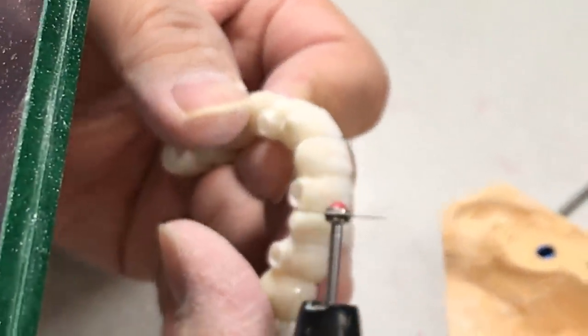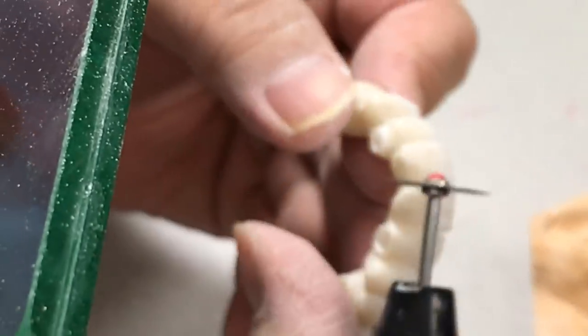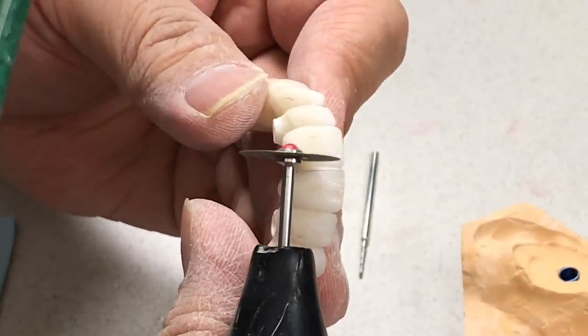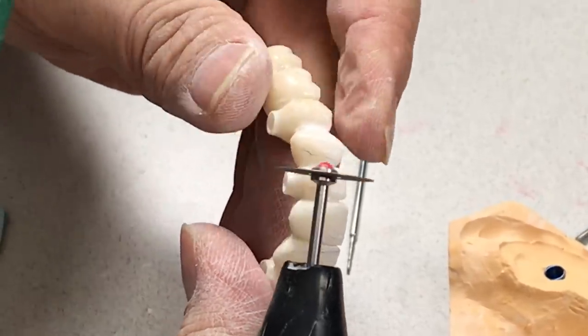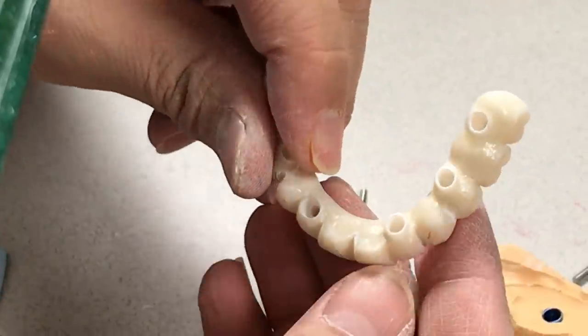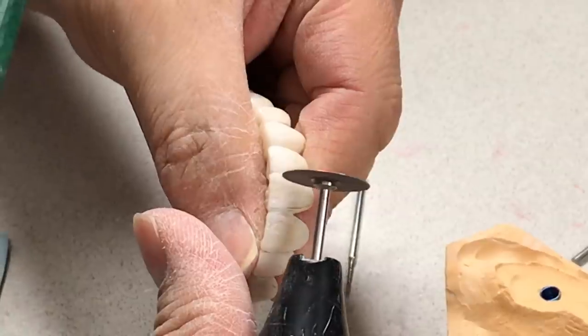Create the gingival embrasure as defined as possible, and try to make the individual-looking teeth to follow the rule. You see — it looks more natural looking from here.